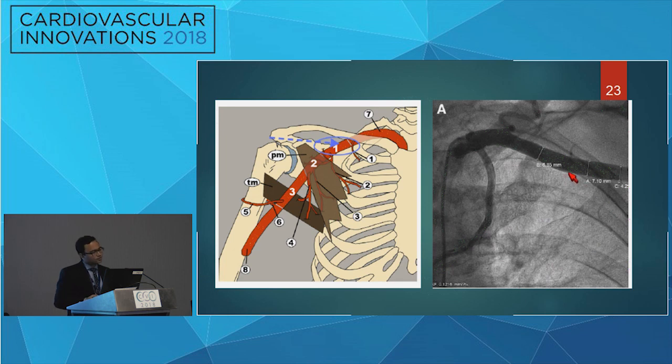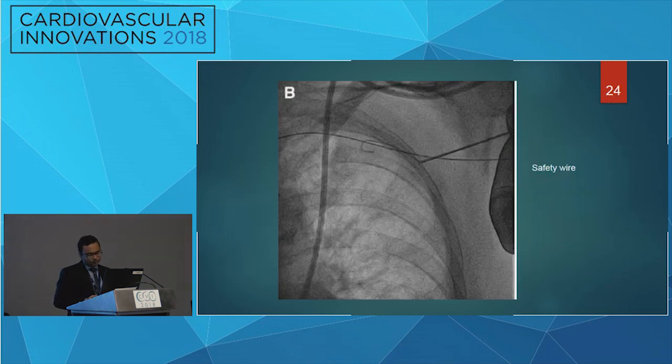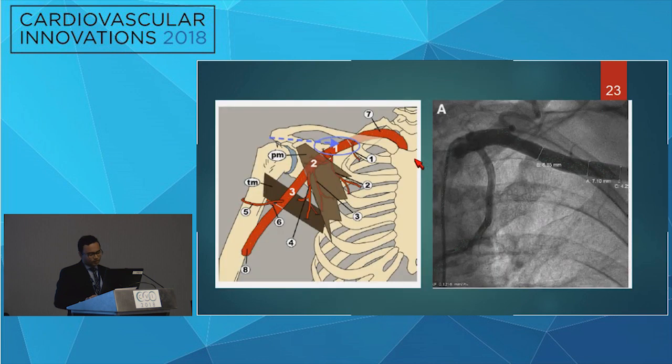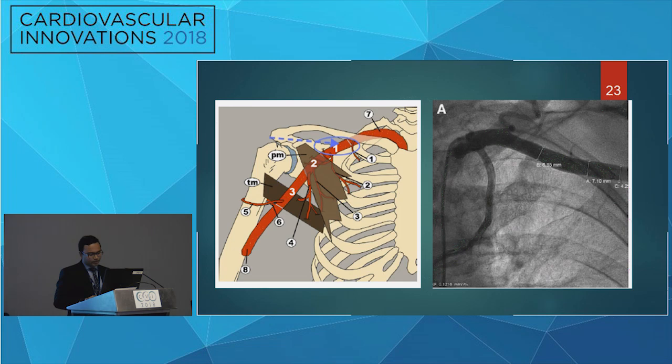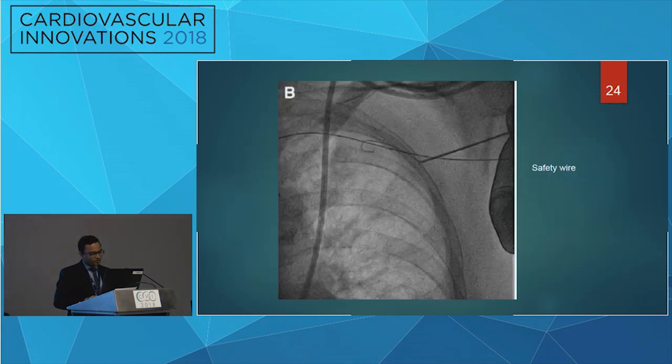So it appeared that you punctured close to where your A marker is, correct? Right there. Looks a little closer actually, here somewhere. Between the two segments is the 1 and 2, where you were? Yeah. It seems a little different in this view, just a little rotated I feel, quite different because the clavicle angle is also different.